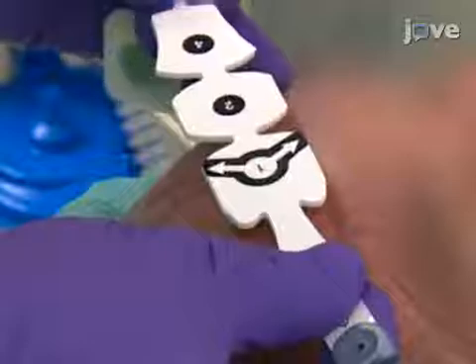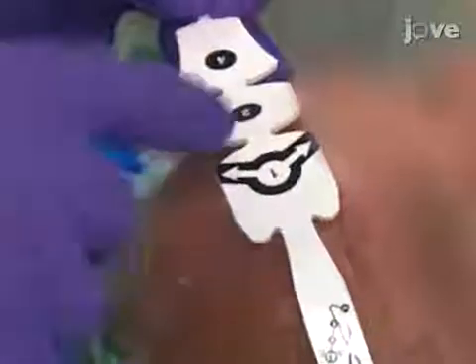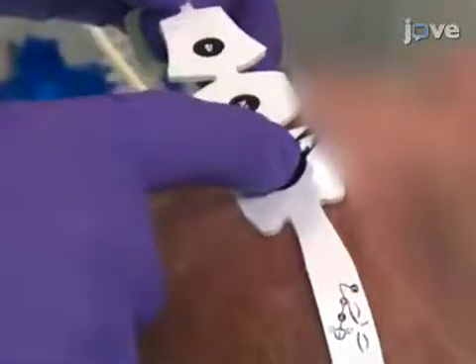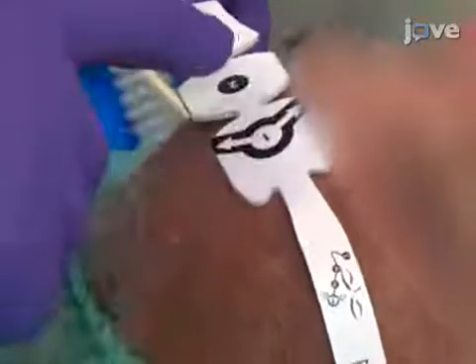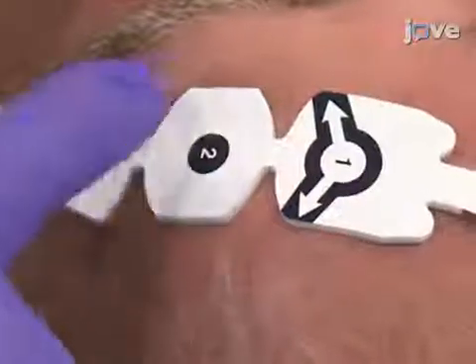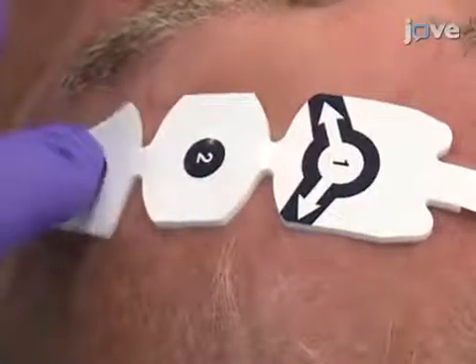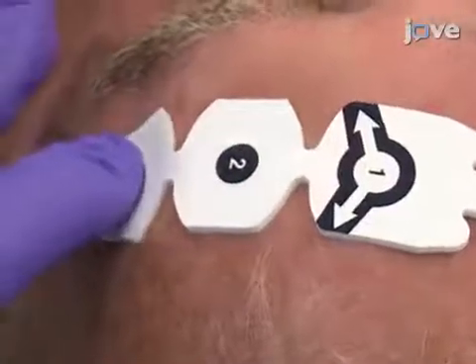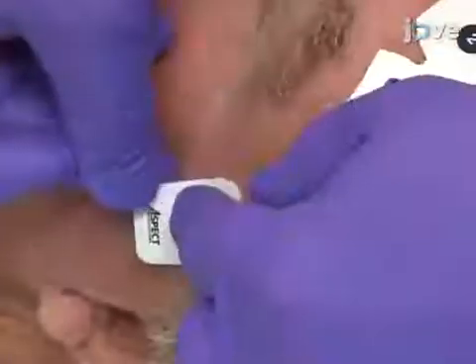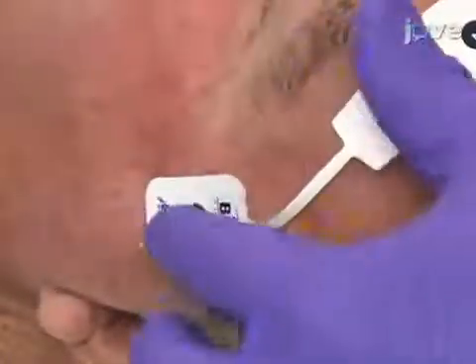When the skin is dry, position a sensor with four interconnected and adhesive electrodes diagonally on the patient's forehead, with one electrode at the center of the forehead, one directly above each eyebrow, and one on the temple between the corner of one eye and the hairline.